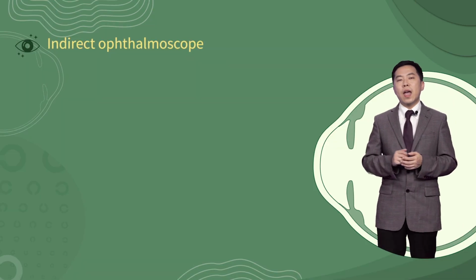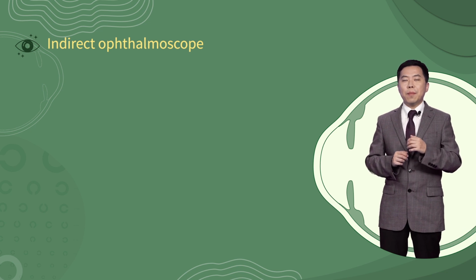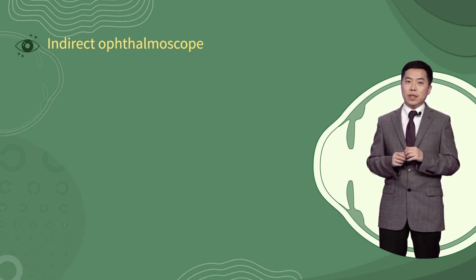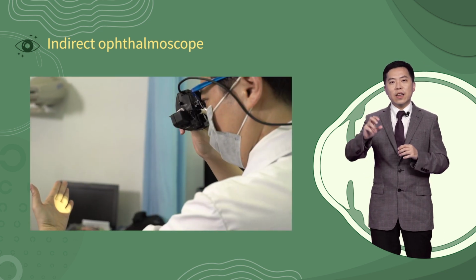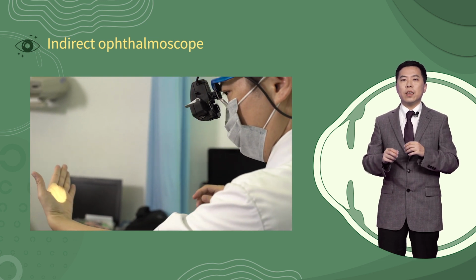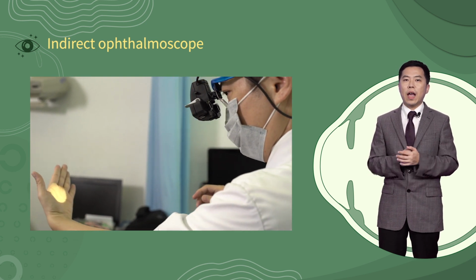Indirect ophthalmoscope provides a wide field but inverted image of the retina. Tighten the headband and then adjust the slider on the eyepieces to meet the interpupillary distance. Adjust the angle and brightness of the illuminating beam so that it falls in the view of both eyes.